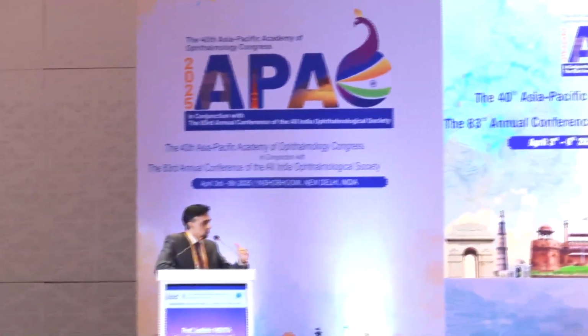Yeah, the main thing about high myopia is three things really. First, whether you can get around the optical effect with the amount of tissue you're removing. The second thing is the nerve recovery. High myopes definitely have more spherical aberration, and they definitely have delayed recovery. But I think those are the things that we can work on to improve. So you can do high myopes and give them the same result as somebody who's -2, -3. And that's why it's important in the literature that it's not biased towards low myopia. If these guys all do really well, it's always the slightly older age group, or the high myopes, that do worse, and we know that. But you need to compare apples to apples to really look at the outcomes.